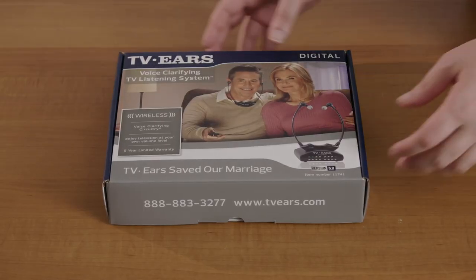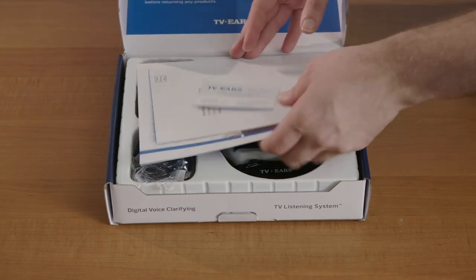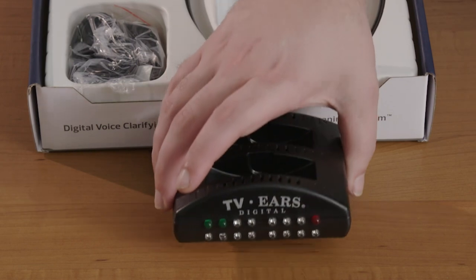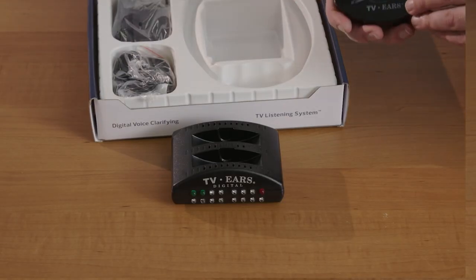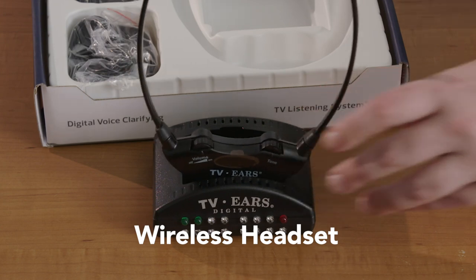When you first receive your TVEARS digital system, the inside of the box should look something like this. If we move all the manuals and paper away, you can see underneath the parts of the system. This transmitter is the device that we would hook up to the TV — it acts as a charger and a transmitter for the headset. Then we have the wireless headset itself, which will work anywhere in the same room as the transmitter.